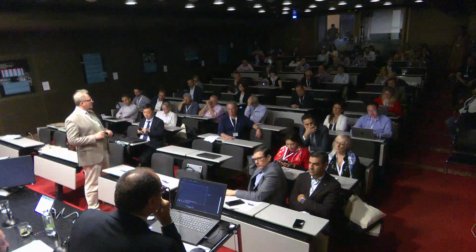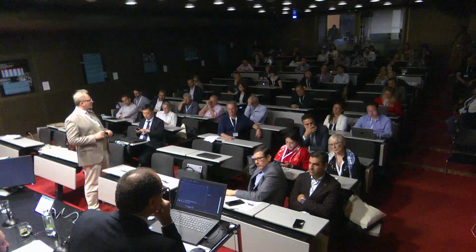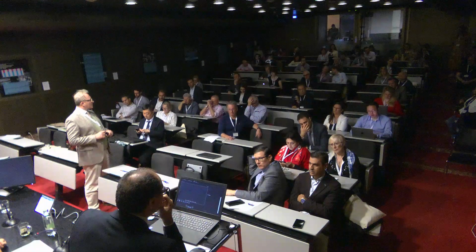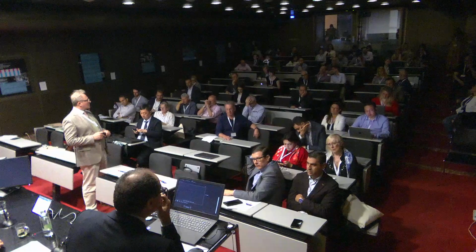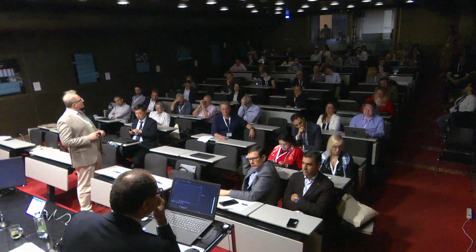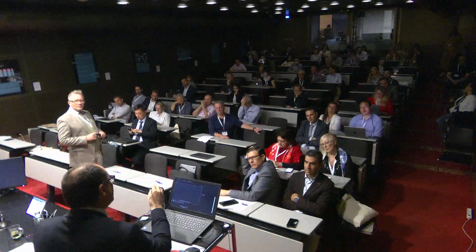MR defecography is clearly useful, but extraordinarily expensive. And it's done again in the lying position, which doesn't give us good physiological information. So I'm really trying to gain, you know, can we use the 3D to help us better understand? I know you've done some work in this area. Can you just share some of your experience and highlight challenges? Thanks. So my answer is no, not this kind of ultrasound.